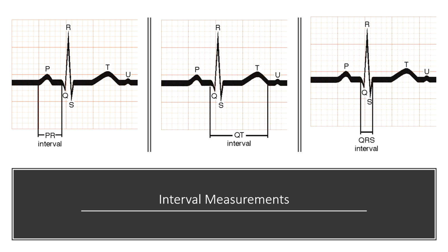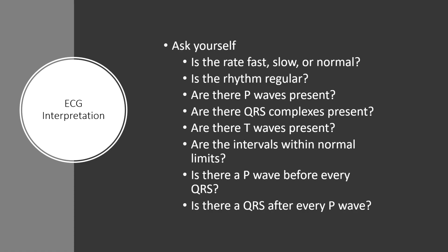But right now, we're going to have you look at what the heart rate is. Is it fast or is it slow? And then if there are any abnormalities. We'll get into more specific pictures. So when we're looking at EKGs, is it slow, less than 60, is it 60 to 100, or is it greater than 100? So is it fast, slow? Is it regular or irregular?